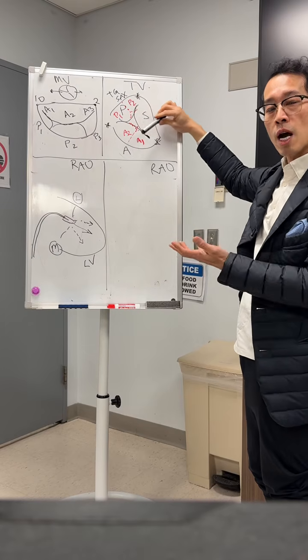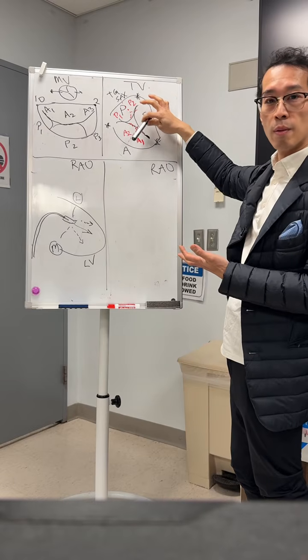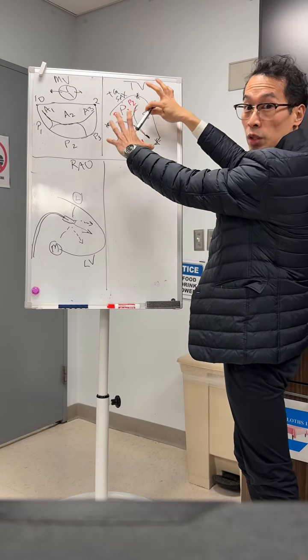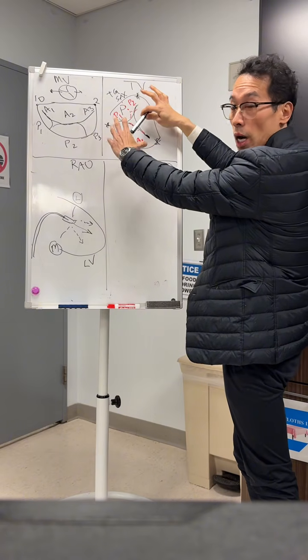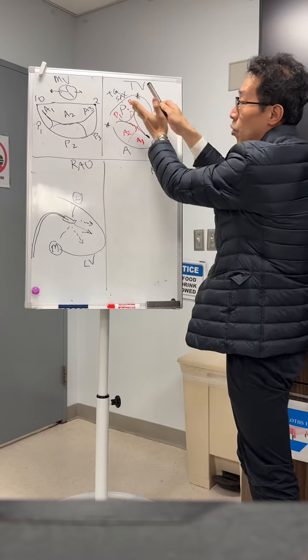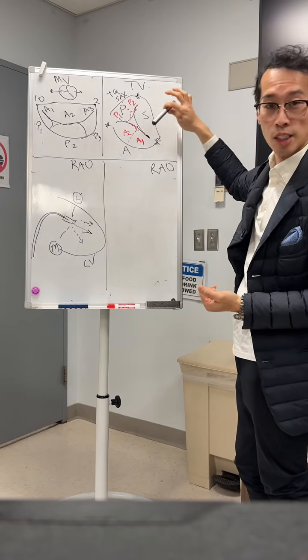You know, let's say you're ready to grasp to go in. And now you want to be able to show that it's the same, because otherwise, if they rotate the valve, 130, 730 is no longer correct. You need to shift it according to the actual coaptation line that they're showing you. So it's really trying to show the same image.